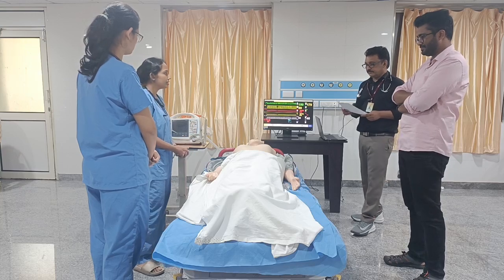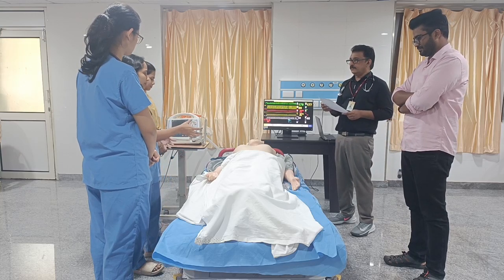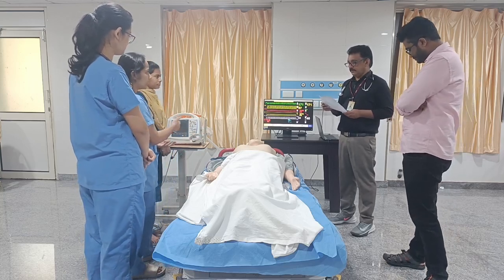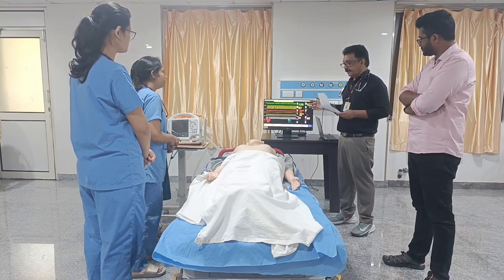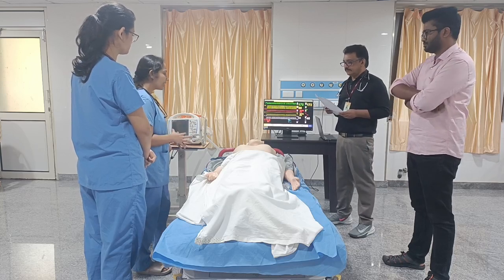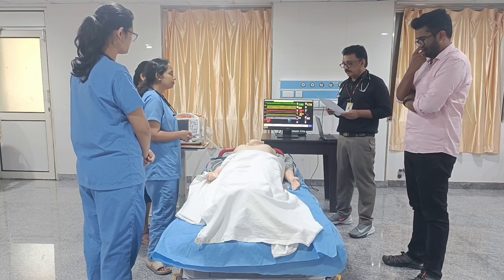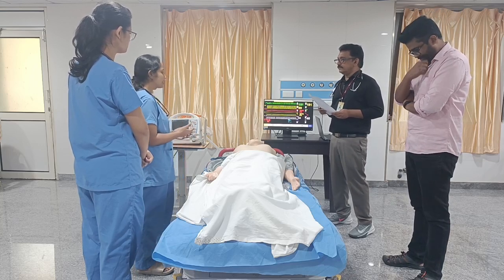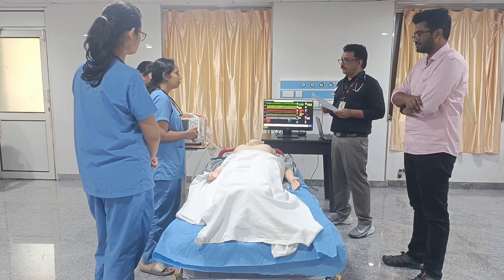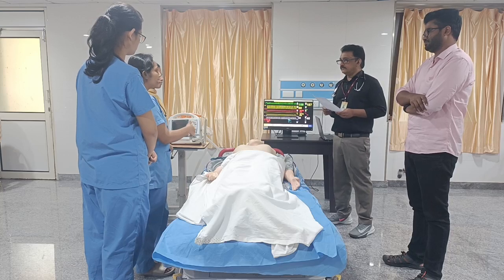As the patient has come with severe breathing difficulty, we will triage the patient, take the patient to the red area, and ask to connect the cardiac monitor. Meanwhile, the 10-second assessment can be started. We will check whether the patient is conscious and oriented, and whether the patient is able to speak in full sentences. He is in distress. Now we will go ahead with the airway.